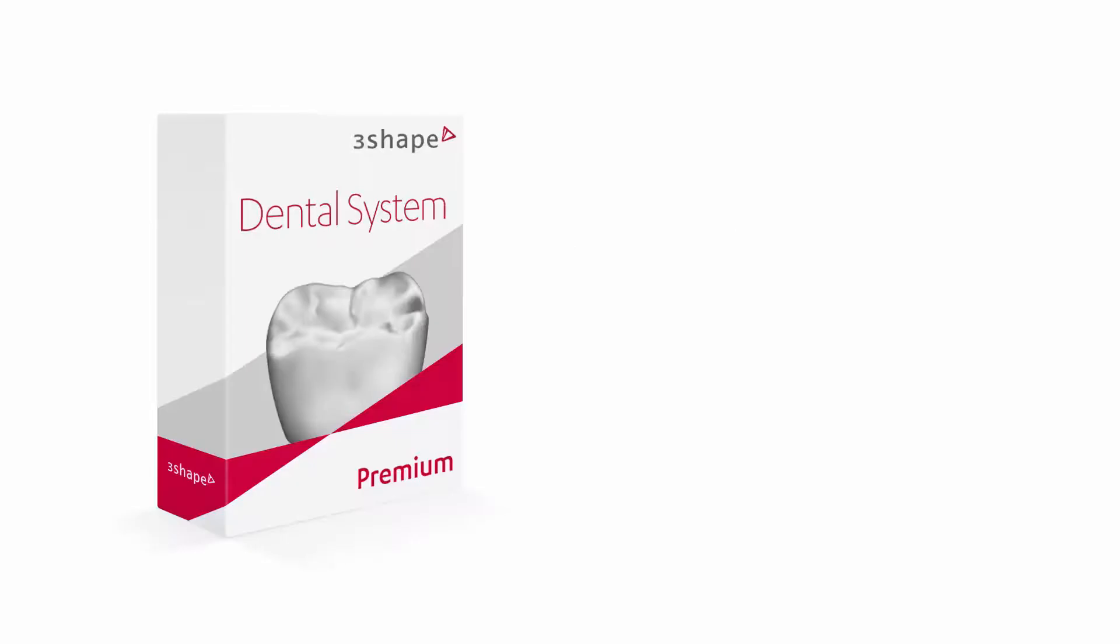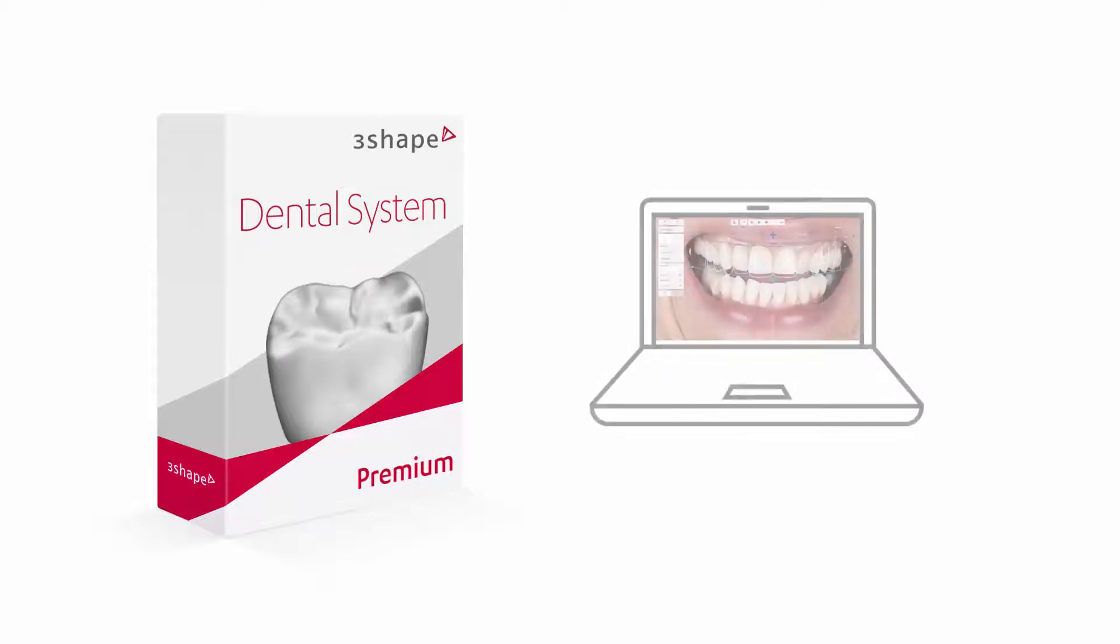While watching this video, you will learn how to successfully install the latest version of 3Shape Dental System with Smile Design on your PC.